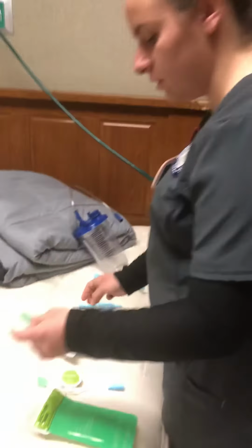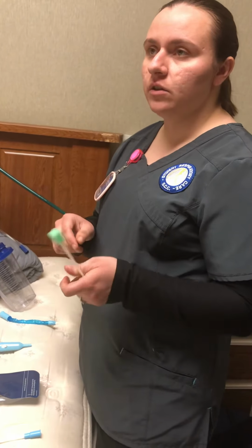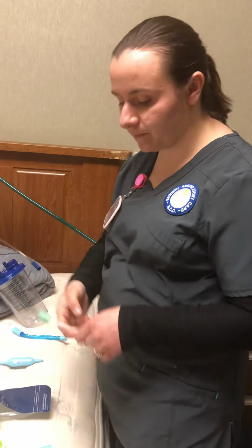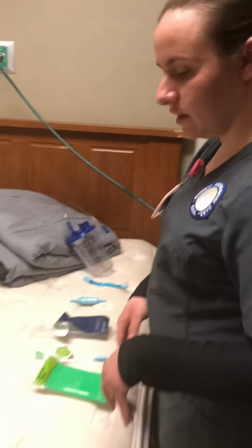Then always after you do any oral cares, you want to make sure you moisturize the gums, the tongue, and the lips. So when you're doing your oral care, if the tube is on one side, see if you can move it to the other side so that way you get both sides of the mouth evenly. And dispose of that. So you want to do oral cares every 2 hours. So the next thing is going to be the cuff management.